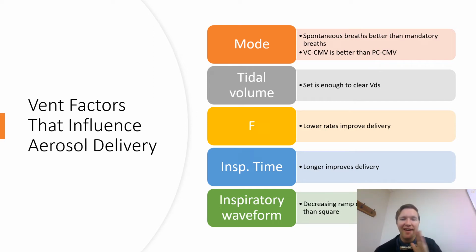So this isn't saying, hey, give the patient a paralytic every time we nebulize something. No, this is just saying in an optimal situation, a slower rate is better than a faster rate for particle deposition. So inspiratory time, the longer the inspiratory time improves delivery. This goes back to your SMI technique for small volume nebs that you learned in therapeutics class. What happens, right? You take that slow deep breath in with the nebulizer, pause, and then let it out, right? Same thing here. So the SMI, in theory, with mechanical ventilation, a longer inspiratory time should help with particle deposition as well.